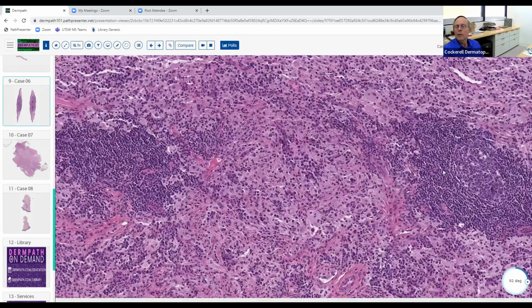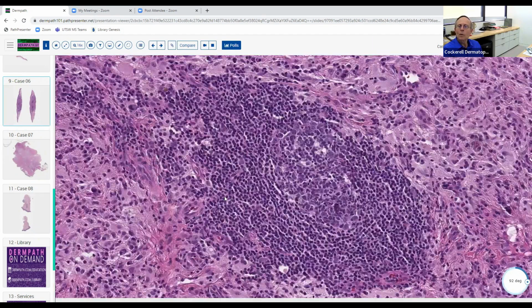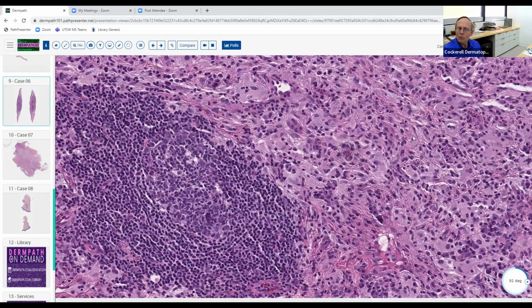So it's one of these things just to recognize histologically. They could easily show you this. If you wanted to confirm the diagnosis and stain these cells here, the histiocytes, what stain highlights these histiocytes? And would that be the CD68? CD68 would highlight them, but they're also highlighted by S100 protein, interestingly enough. So they're clearly not Langerhans cells themselves, but they're probably somewhere in the Langerhans cell lineage because they have that S100 protein staining.